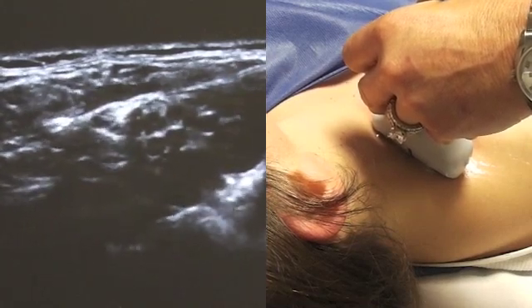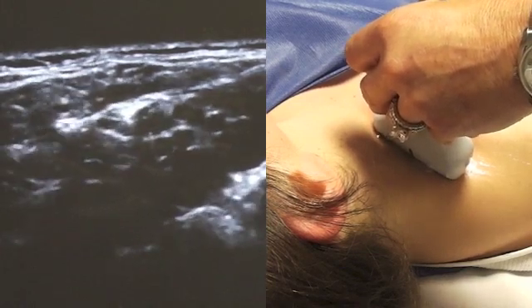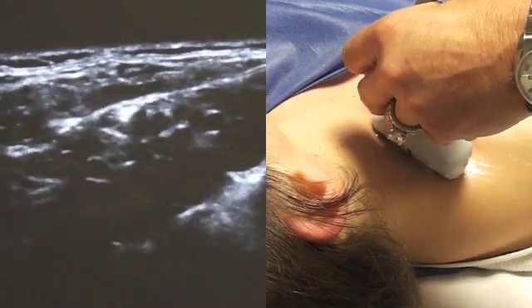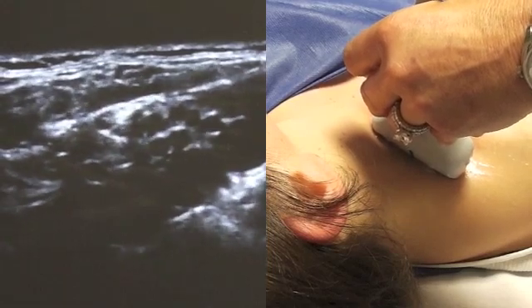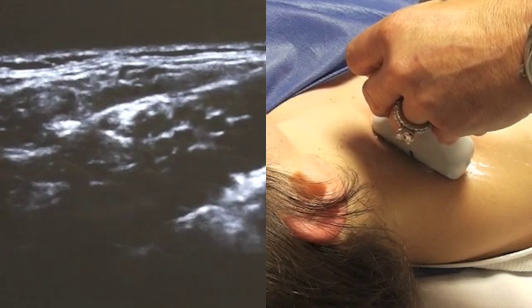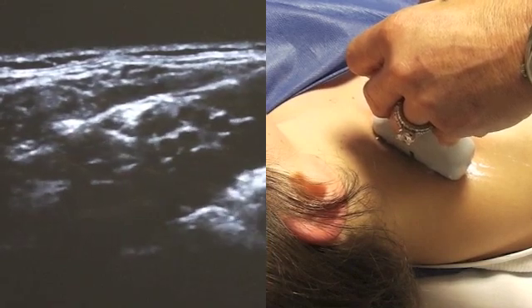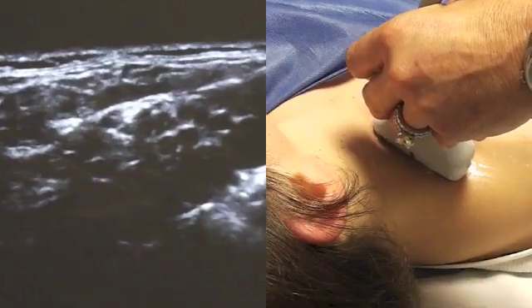At that point, we will inject the final injectate of 15 ml of half percent ropivacaine. Once we confirm good spread of local anesthetic, we will either remove the needle if it is a single shot block, or place a catheter. The important thing to note about a supraclavicular catheter is you do not want to thread the catheter too far. The key is to only thread the catheter about a half to one centimeter beyond the needle tip, in order to ensure that you are optimizing the distribution of local anesthetic in the plexus and not far away from the plexus.